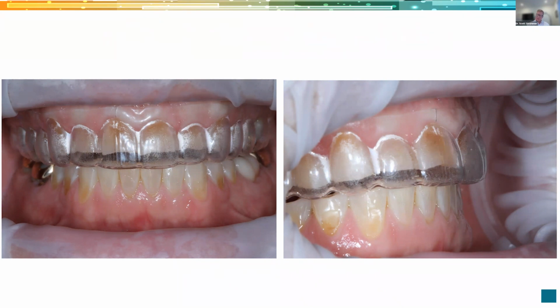And for those of you that have done cases like this, personally, if I didn't do it this way, I get lost. I end up in these cases having a tendency to over prep or take away more tooth structure than I had to. So just by taking the time, following the recipe, it makes it easier for me chairside.